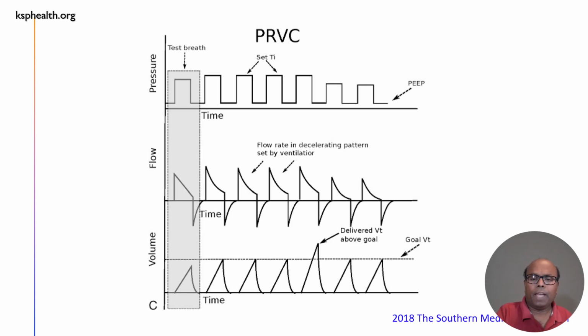Based on the preset values, it gives such a pressure so that the preset volume is achieved, and keeps doing that every breath, reanalyzing the data and delivering appropriate pressured breaths in subsequent breaths. So it is like having a miniature respiratory therapist within the ventilator. He monitors every breath instead of every 2 hours or every 3 hours.